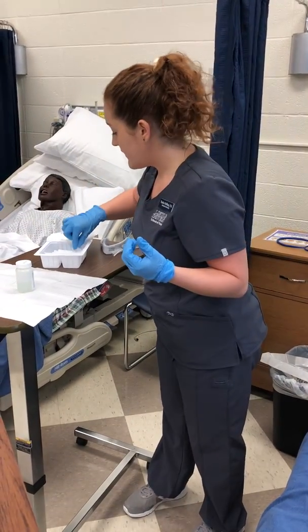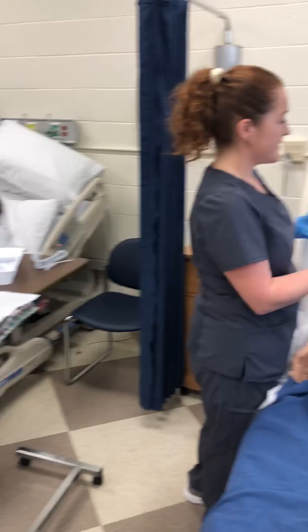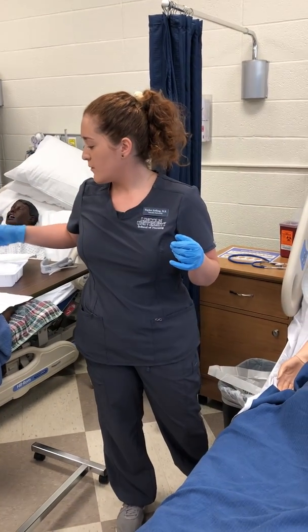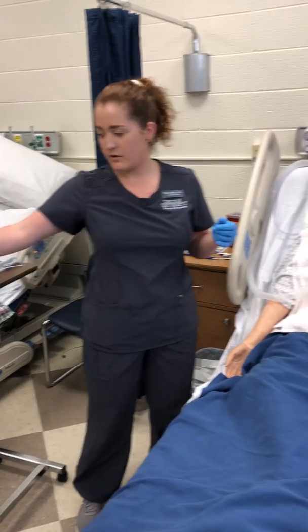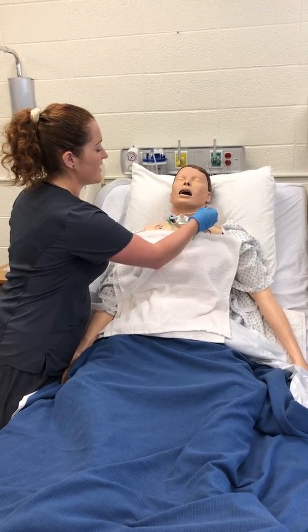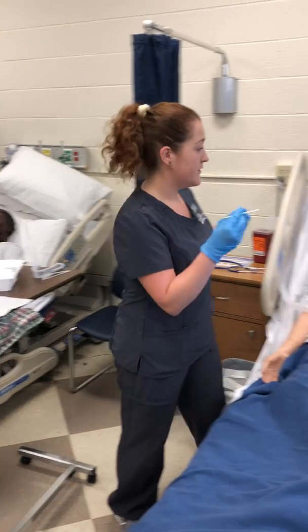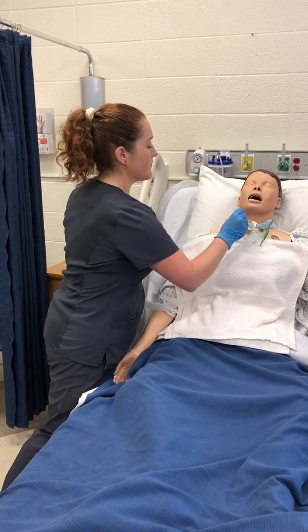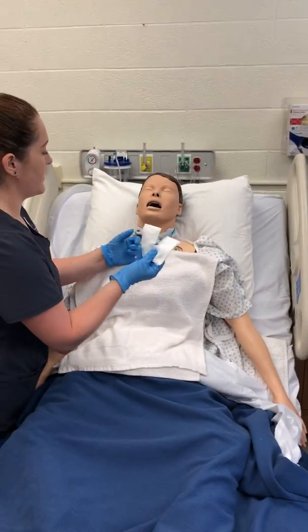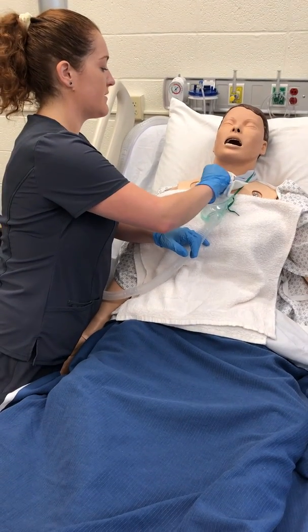We also have a dressing change to do. I have a drain sponge that I'm going to place underneath the trach after I swab around a bit. I'm going to dip one of the cotton tips in normal saline and clean around the edges, underneath, removing any crusty areas or anything that will irritate the skin. Then I'll use a dry one to dry the area. With the drain sponge, I'm going to stay as sterile as possible and make sure that everything is good and clean.